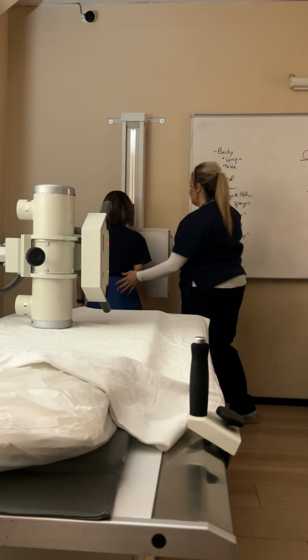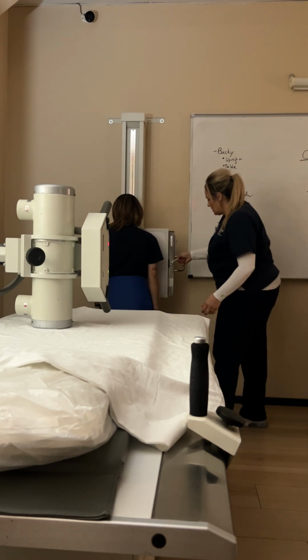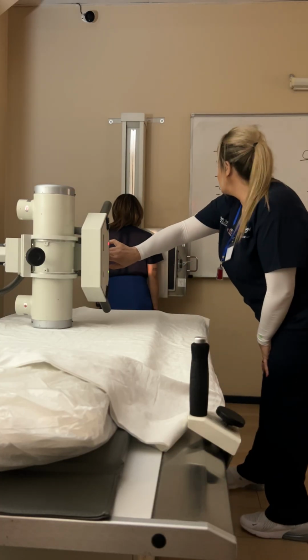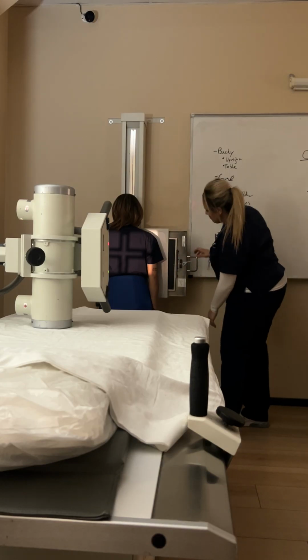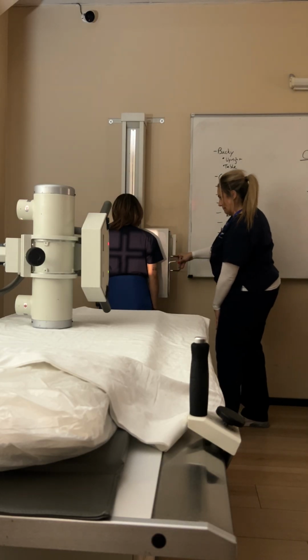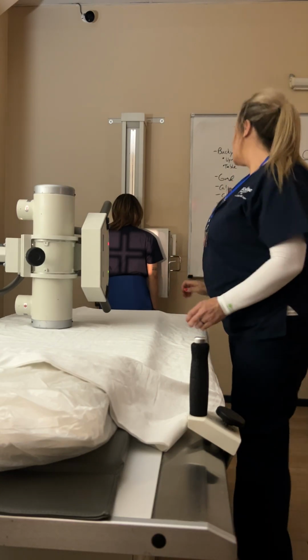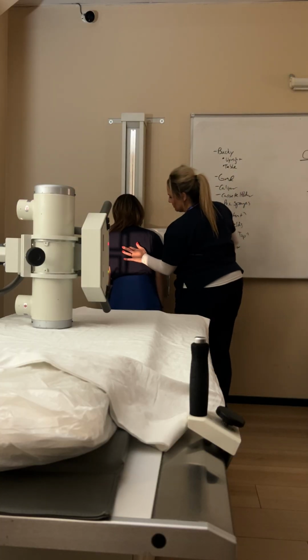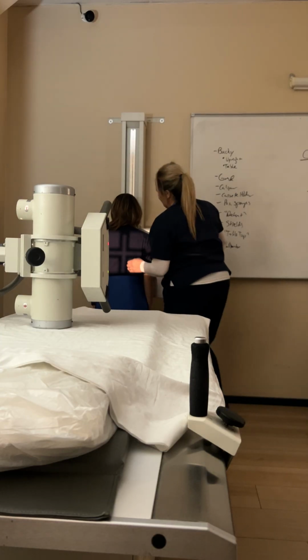Gotcha. Okay. Let's try this one more time and make sure you're in the center. What we're doing is refining your process. It's a little high. This will be lined up before you ever bring the patient in. Would you have them come in to measure? We don't have to measure, just eyeball it. This is all set up before I ever run anybody in. Then I'm going to grab my patient.